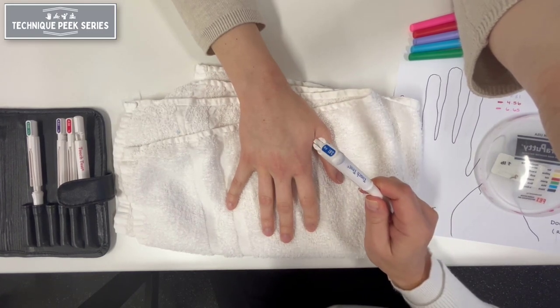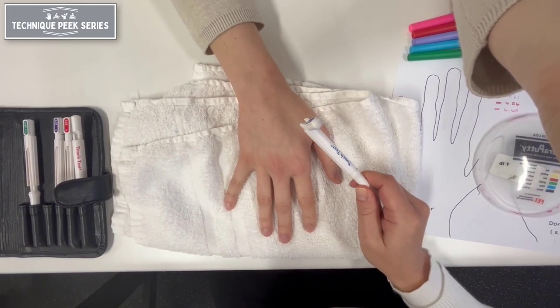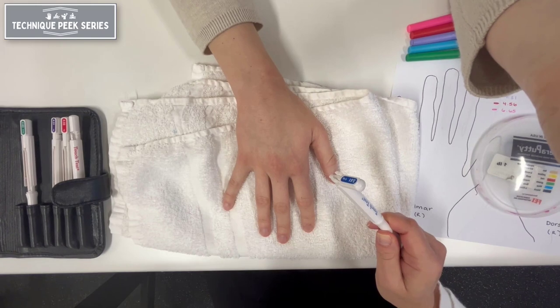If the patient does not respond to the stimulus, choose the next largest monofilament and repeat the process.